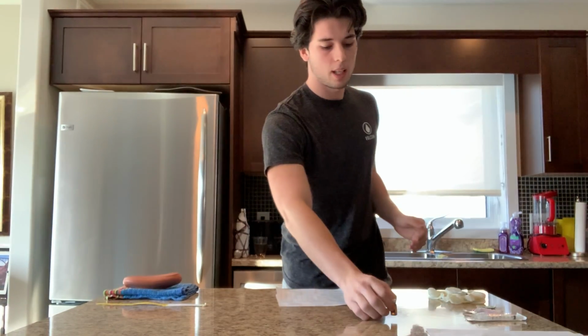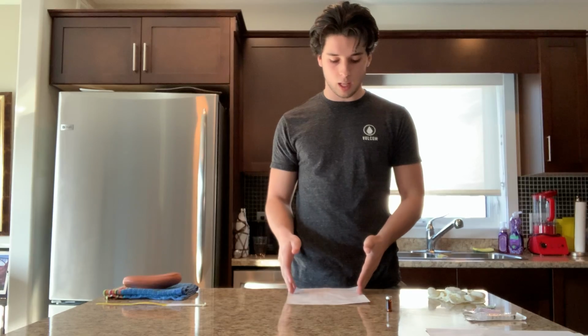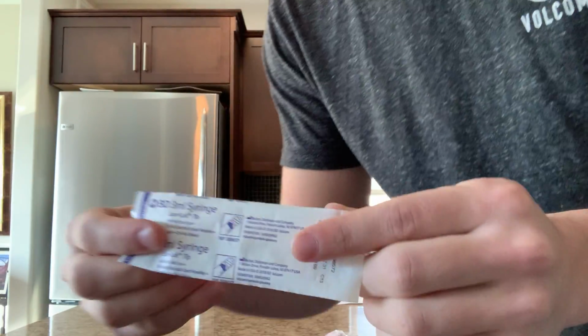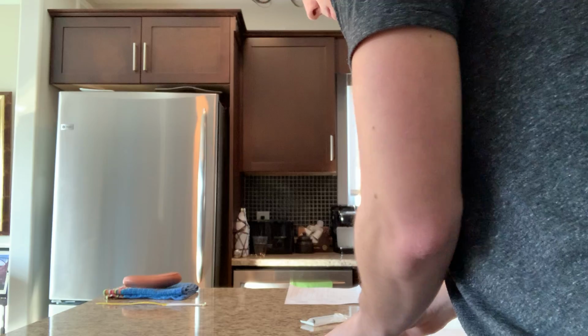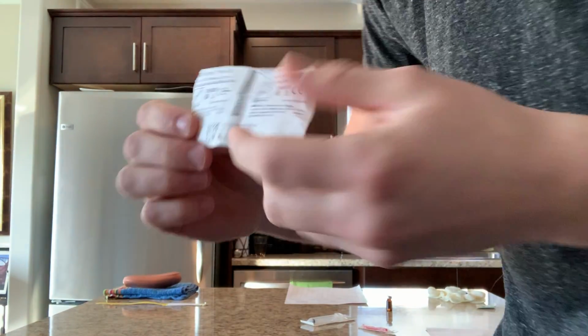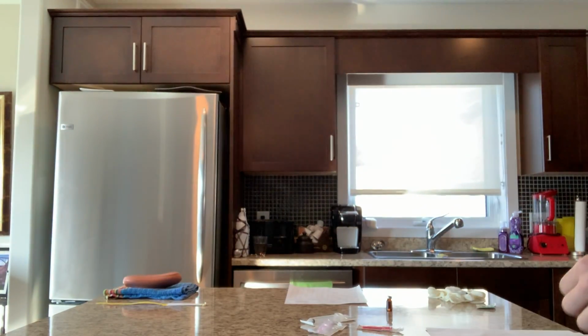Now that we have the medication we are going to be using, we will gather our supplies, our needle and syringes that we will be using for this demonstration. So for this demonstration, subcutaneous injection, we will be using a 3 milliliter Luer-lock syringe. We're going to be using a blunt fill needle, as well as a 27 gauge half-inch injection needle for this subcutaneous injection.